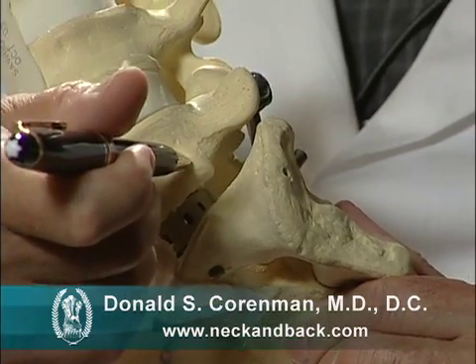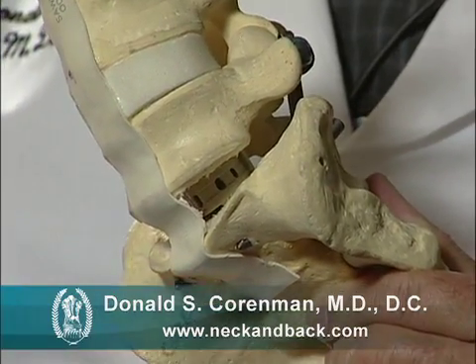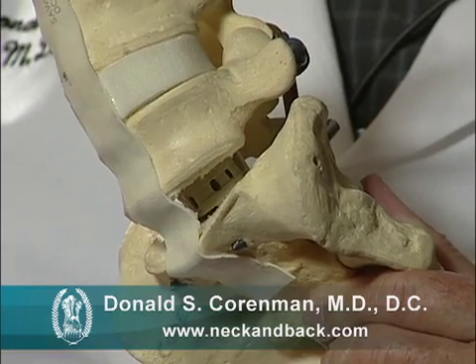If you look here, you'll see that there is a little plastic cage in here which separates the two vertebrae. If we didn't put a spacer in there, the vertebrae would collapse down on each other and anatomically your spine wouldn't align correctly. So we put that spacer in there so that it aligns anatomically and makes more room for the nerves.